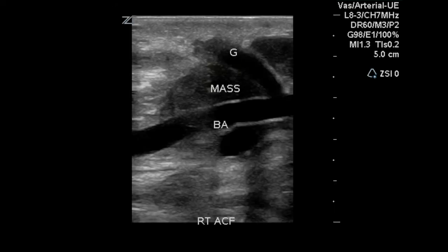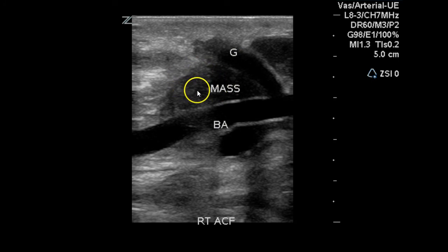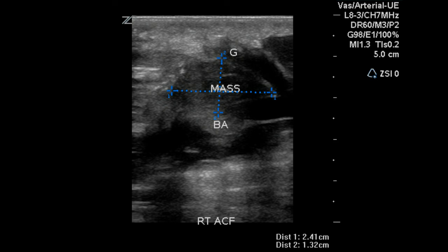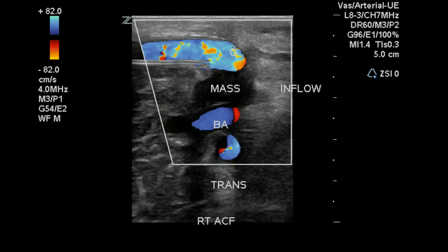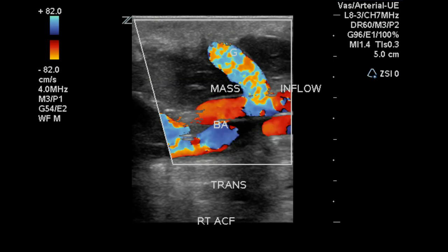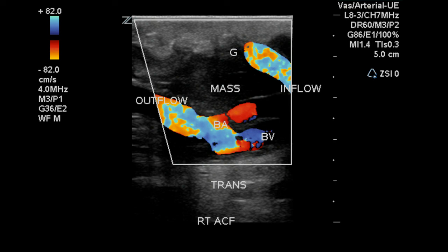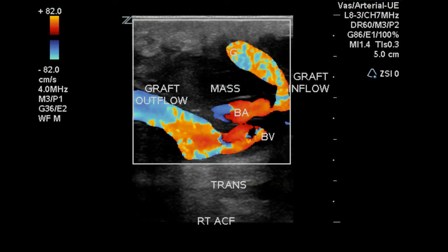At this point, the sonographer has completed the general portion of the graft exam. However, they've gone back to re-evaluate the area noted on the first image. We can see the brachial artery and the graft anastomosis with what they're calling a mass in between, measuring 2.4 by 1.3 centimeters. There's no color flow identified within the mass, although flow is found in the artery and in the graft. Various angles are evaluated to establish if it's vascularized or avascular. If no flow is found within the mass, it is most likely a hematoma with a patent AV graft.